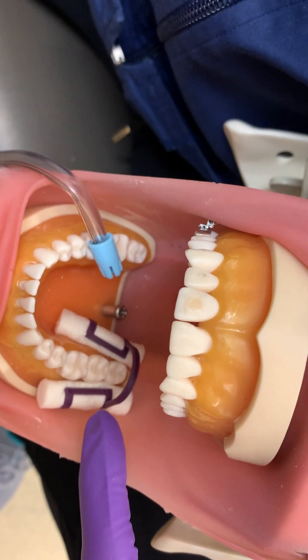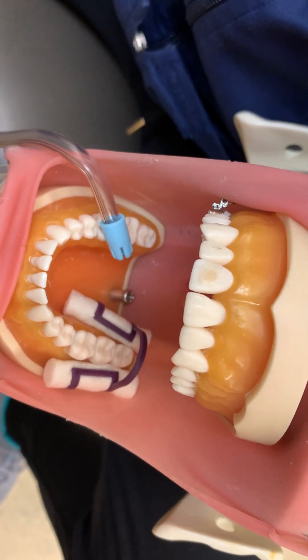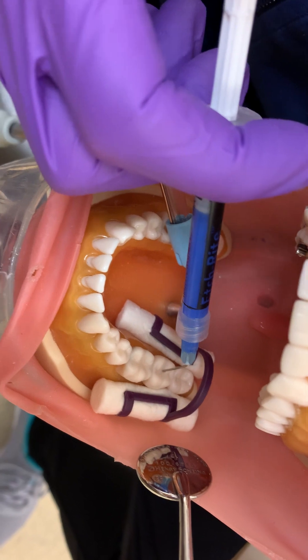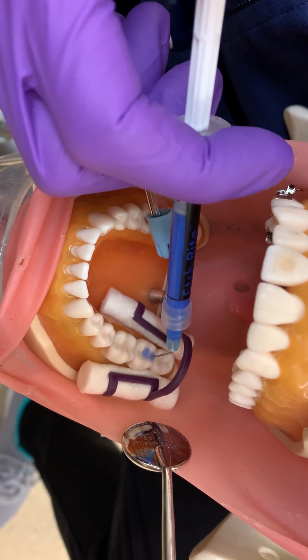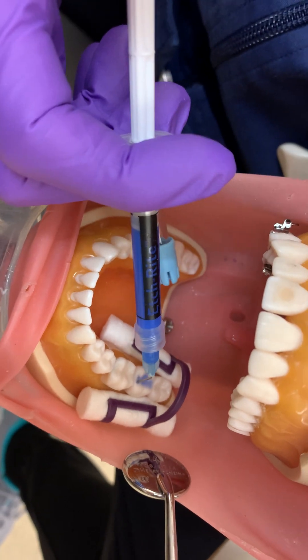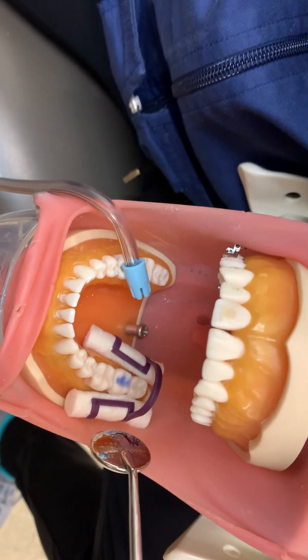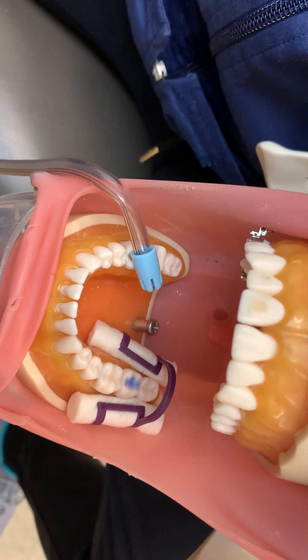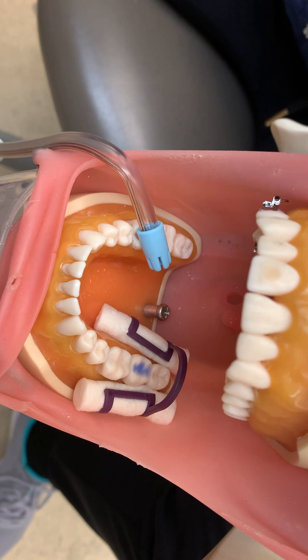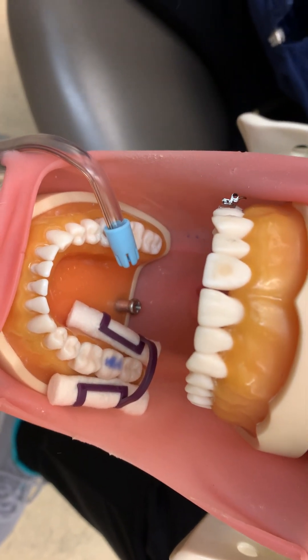You're going to apply the acid etch according to manufacturer's directions. It is always important to read about the product you're using. We're using 38% phosphoric acid, and the product we're using today is Etch-Rite. The manufacturer's instructions for Etch-Rite is to etch for one minute, but they all vary, so ensure that you are educated on the products you're using before you use them.